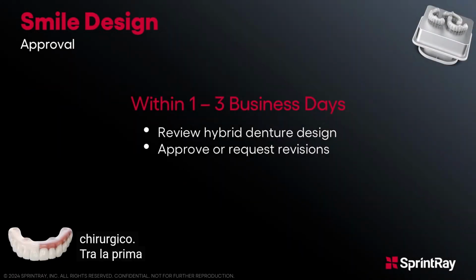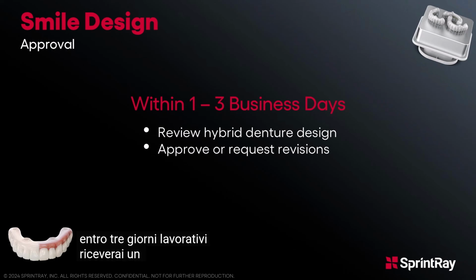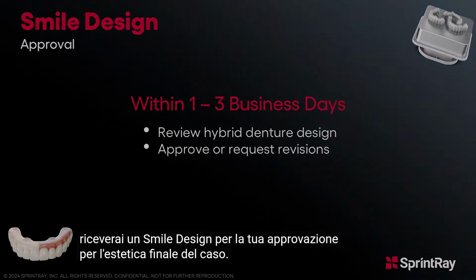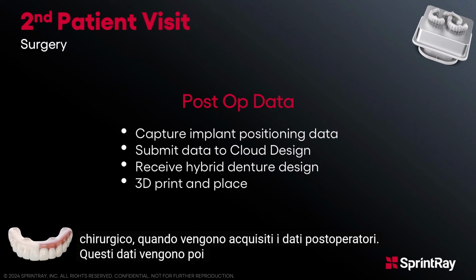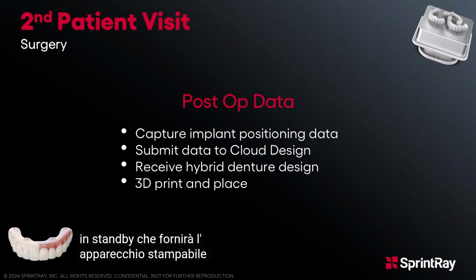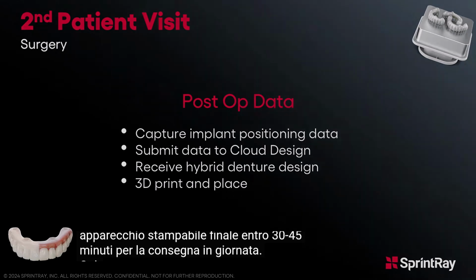Between the first patient visit and the second patient visit, within 3 business days, you will receive a smile design for your approval for the final aesthetics of the case. The second patient visit is the day of surgery when the post-op data is acquired. This data is then supplied to a designer on standby who will provide the final printable appliance within 30 to 45 minutes for same-day delivery.